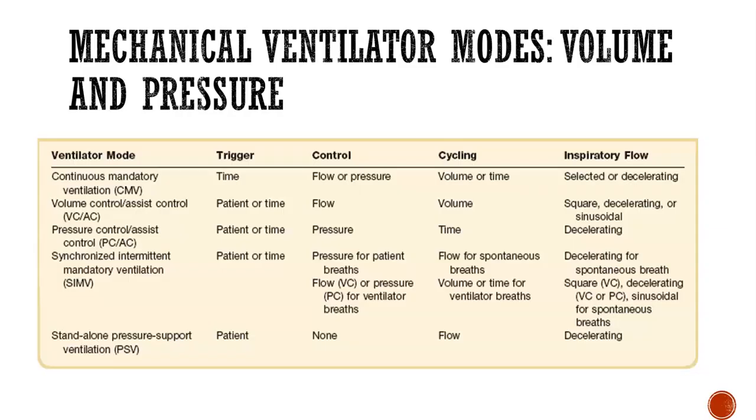And then pressure support, PSV, has no set respiratory rate. All breaths are spontaneous. No machine breaths are required. PEEP is the only pressure that remains in the circuit upon exhalation.